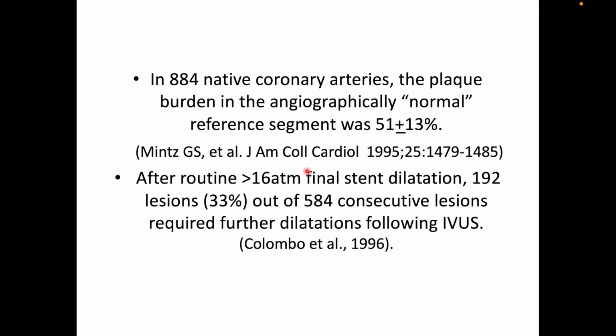So Gary Mintz has done huge work on IVUS. And in one of his publications, he showed that in 884 native coronary arteries, the plaque burden in the angiographically normal reference segment was 51%. So these are angiographically normal appearing vessels, but the plaque burden was 51%.